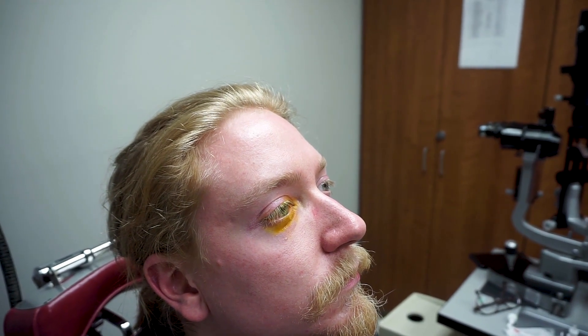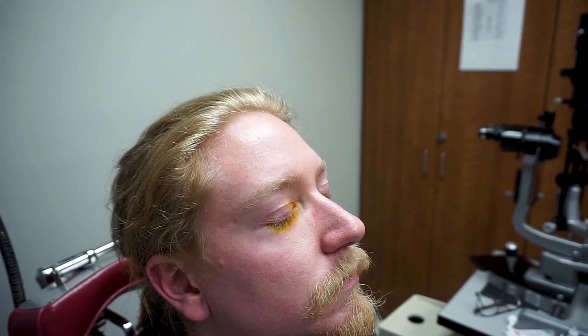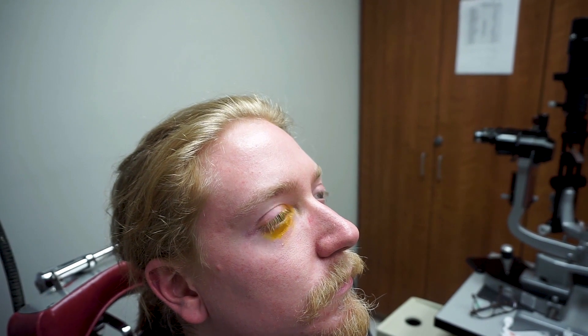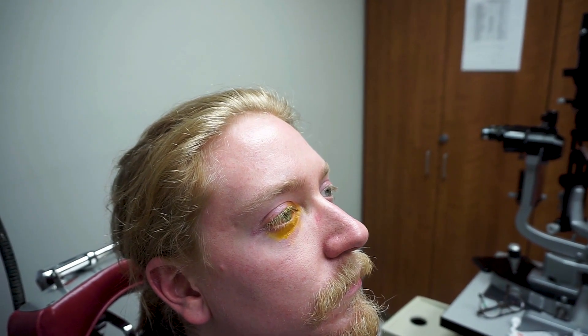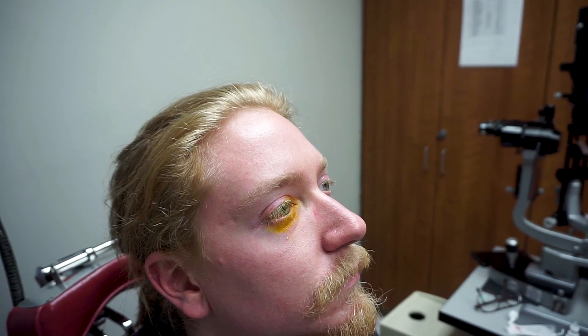If this occurs, have the patient blink multiple times to clear the fluorescein. At times, placing one to two drops of saline into the eye may be required.